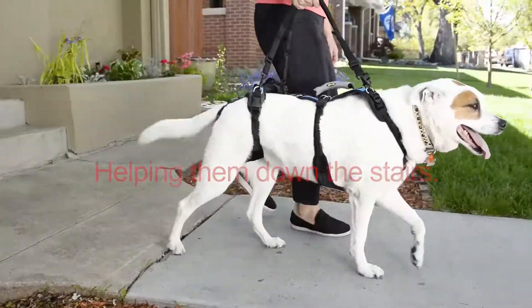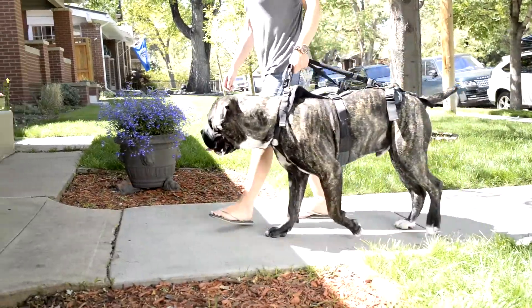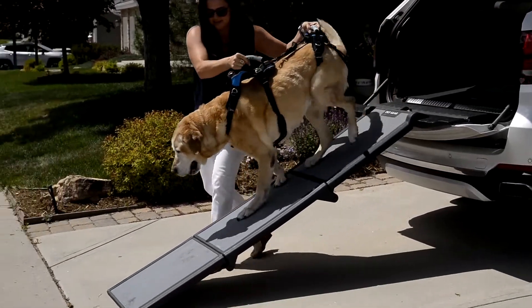And now we offer a full assortment of walking leashes, a walking handle, and our new Walking Loops, which lets you assist the part of your dog that needs the greatest assistance — perfect for dogs needing a little support while squatting.